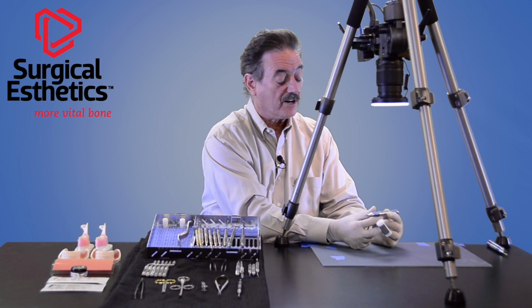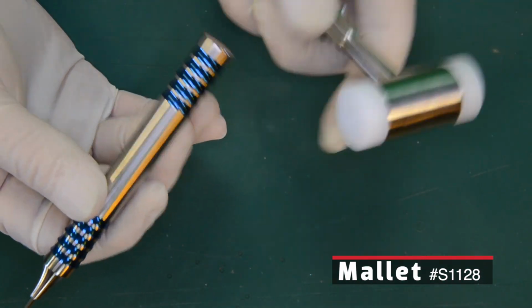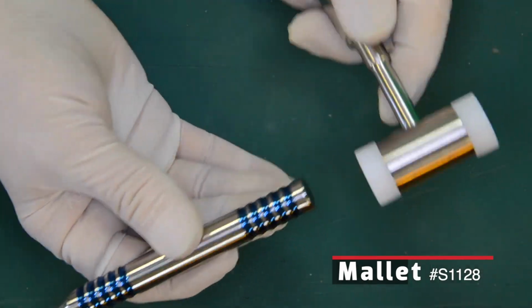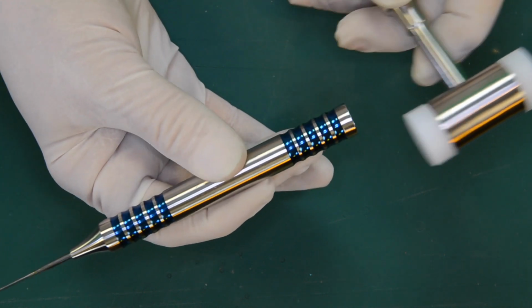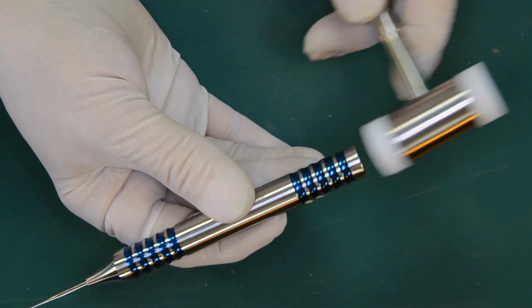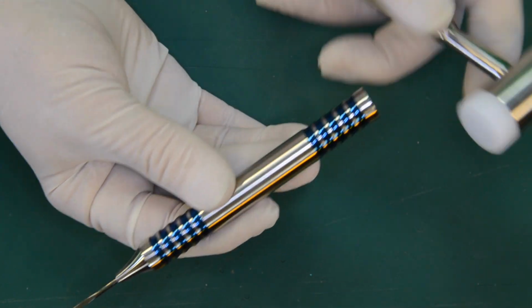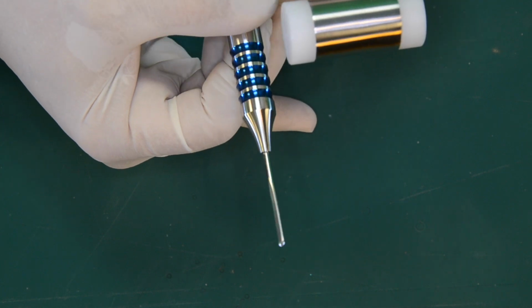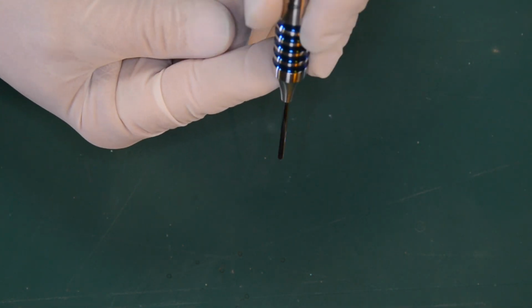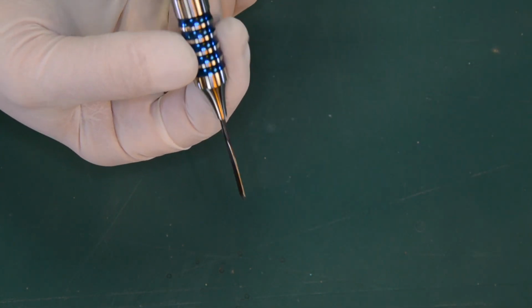So you can see we have our typical mallet, and we don't ever want to call this a hammer. It doesn't sound so good for our patients. When we use the mallet, you don't use a lot of force. Always let your patient know they're going to feel a little tapping, and it's simply used like that. With two to three taps, the instrument advances up the periodontal ligament space. We use a buccolingual movement, which allows the cutting of that ligament.